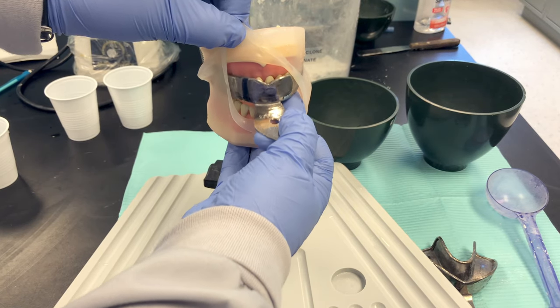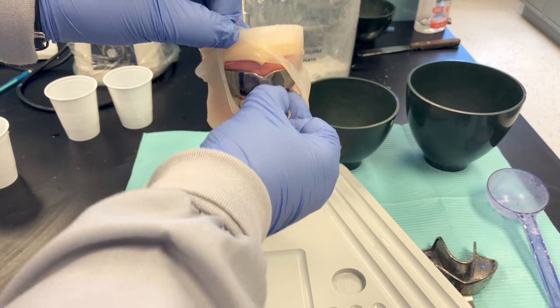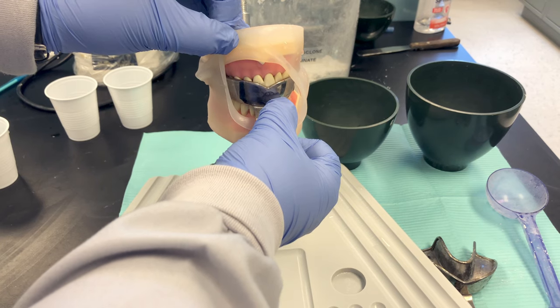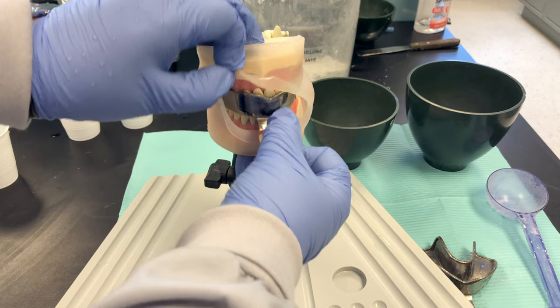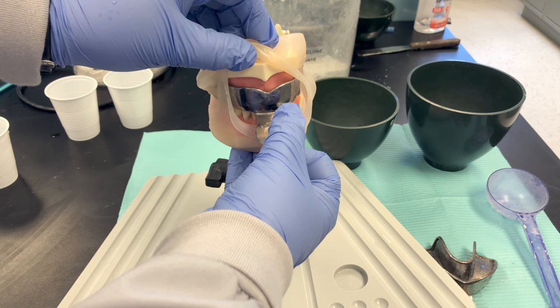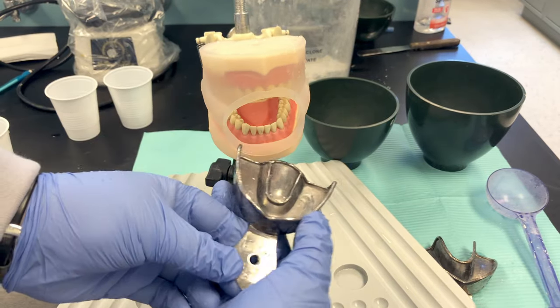Also make sure the tray has a buffer zone between the tray and the teeth — we don't want the tray scraping against the front teeth. We need room for impression material. Don't push it in as far as it will go; let the tray come out slightly, about a quarter of an inch. If you have a good fit, remove the tray at an angle and take it out.